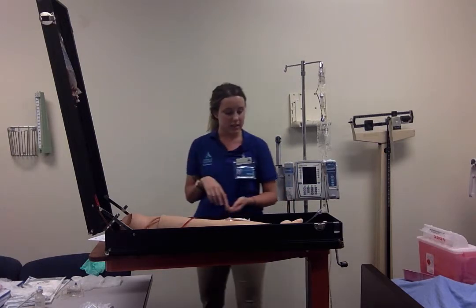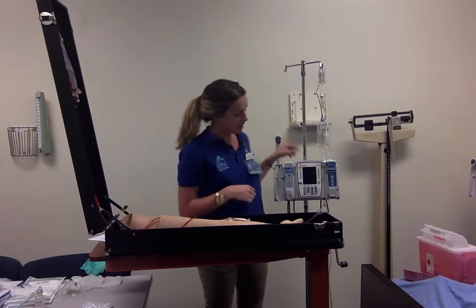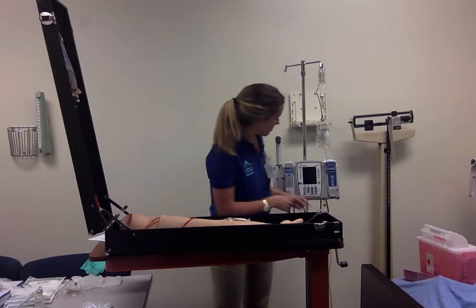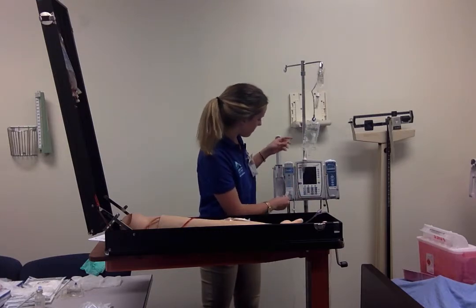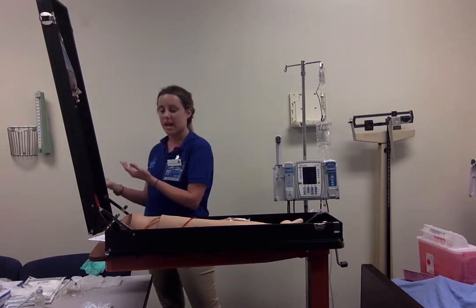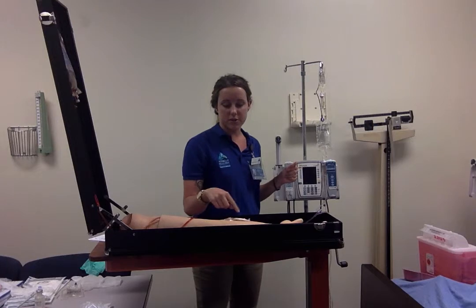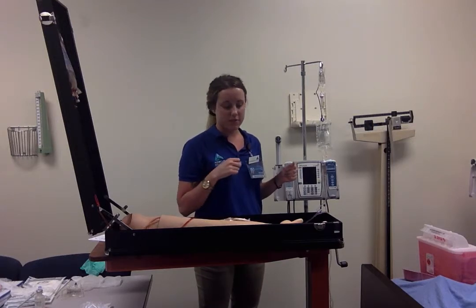I'm going to come back in. I'm going to observe the infusion, make sure it's completely gone. I'm going to clamp the piggyback that is empty. And I'm going to wash my hands and apply clean gloves. And again, make sure there's no redness or inflammation.